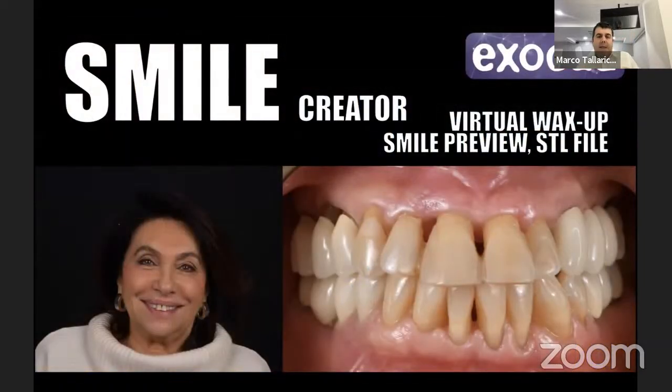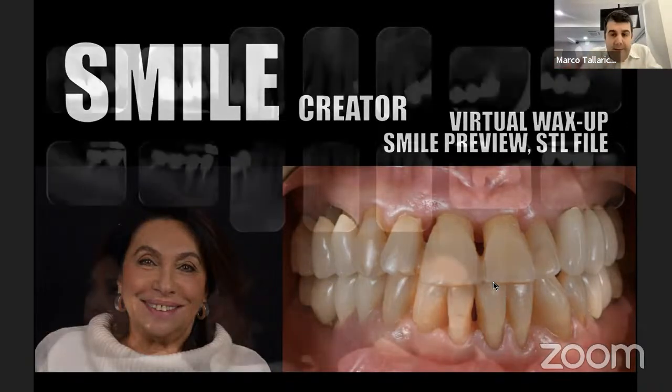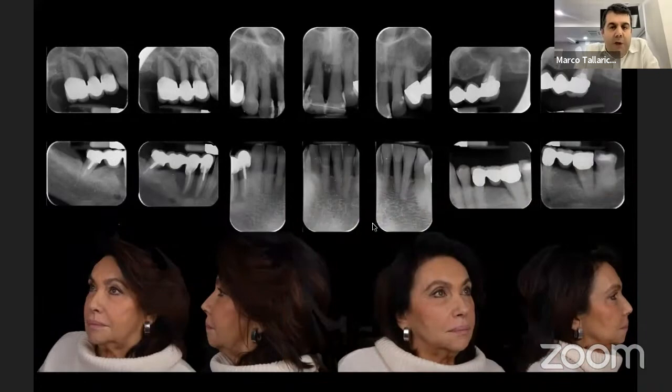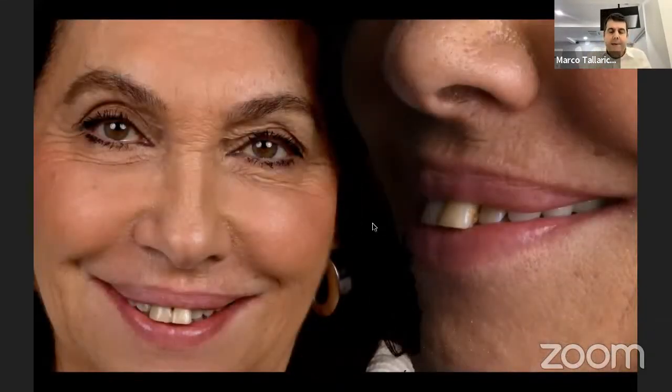For example, with this patient, we need to extract some upper teeth, but we need to make a workshop. The patient is also a little bit older, but she feels very young. So she wants very wide teeth. This is the situation from a periodontal point of view. So we need to extract the molars in the upper and lower jaw, and we need to cover the anterior teeth.